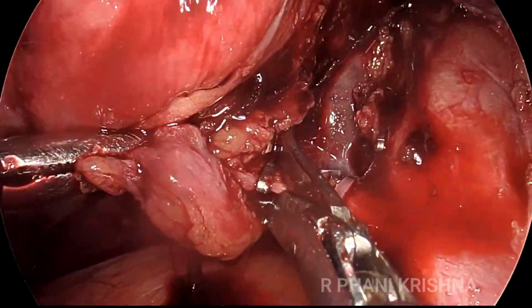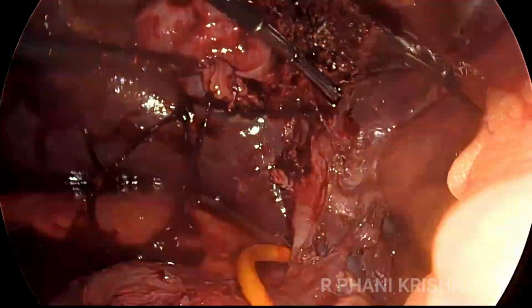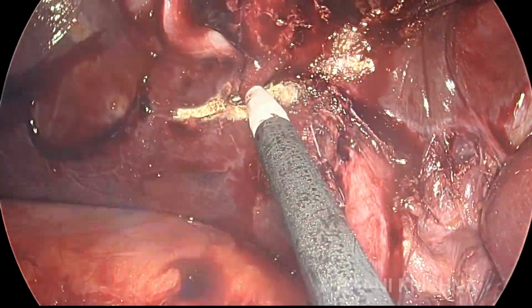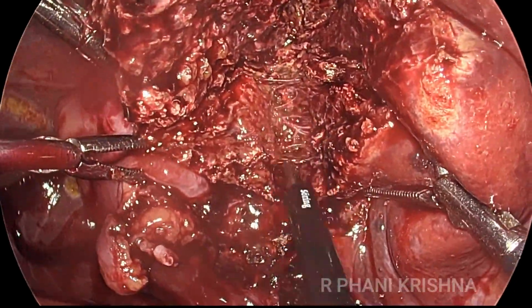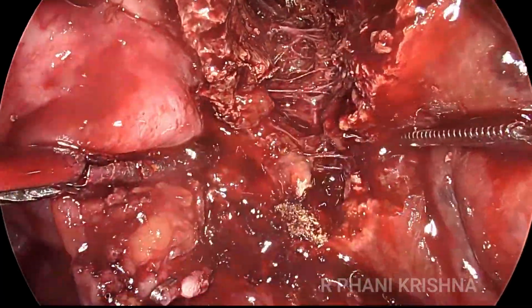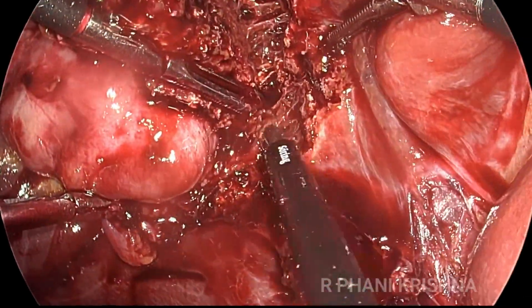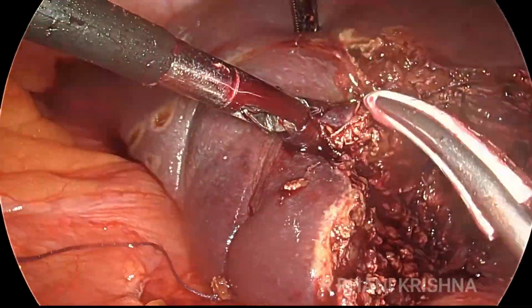The cystic duct is now being doubly clipped and divided so that we have access to the region of the parenchyma behind the neck of the gallbladder. Like I said, the wedge does not go to the liver hilum. We stay about a couple of centimeters away from the area of the attachment where the neck is transitioning into the body. To that area only the parenchymal transection tapers down, because there you have the right Glisonian pedicle. Then if a tumor is actually infiltrating that deep, a wedge liver resection at 4B5 will not suffice. You need to do a hepatectomy.